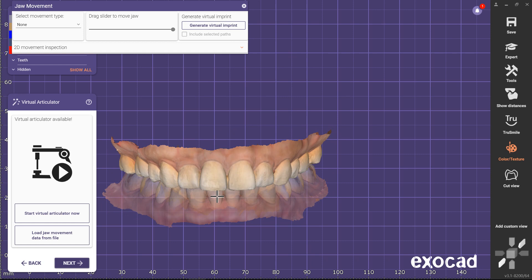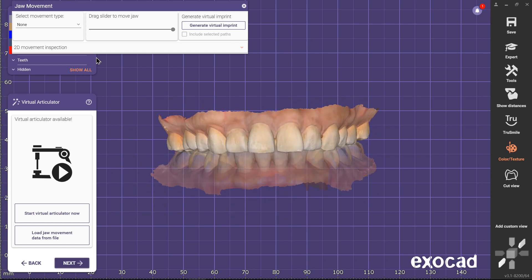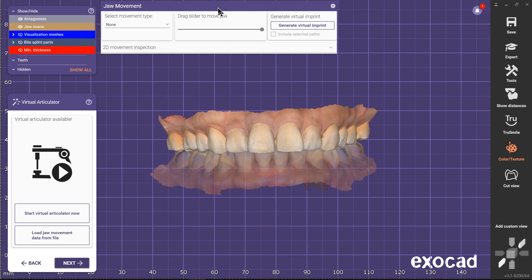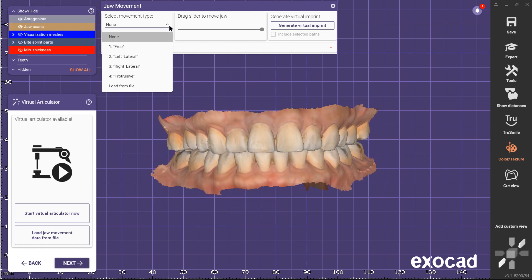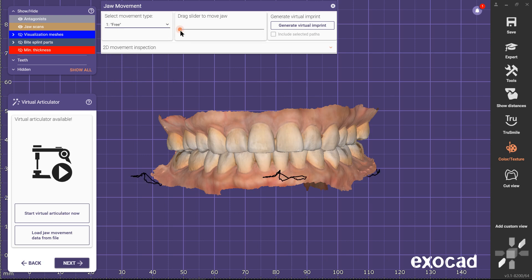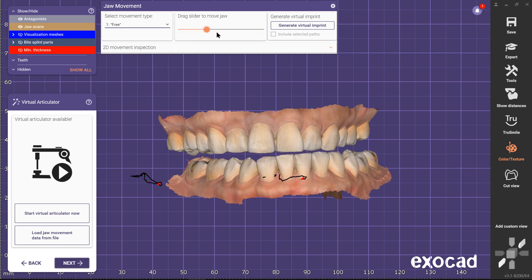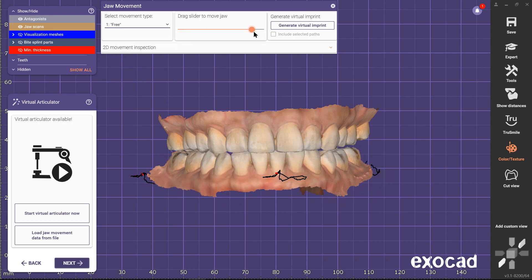Now, in Movement Type Selection, you can choose and visualize each of the four mandibular movements by using the slider on the right.